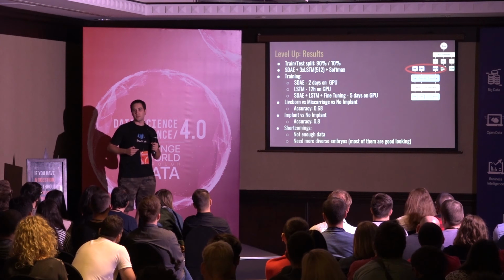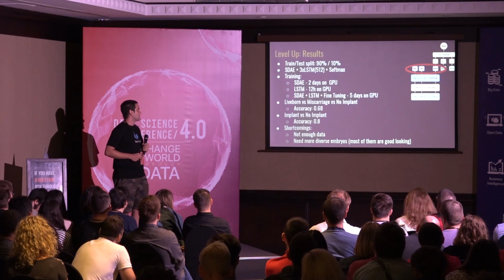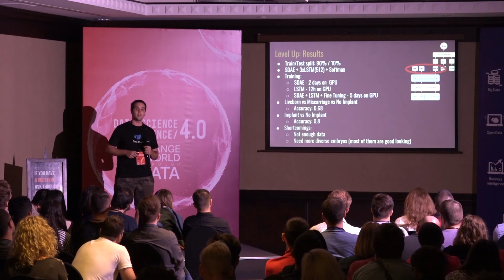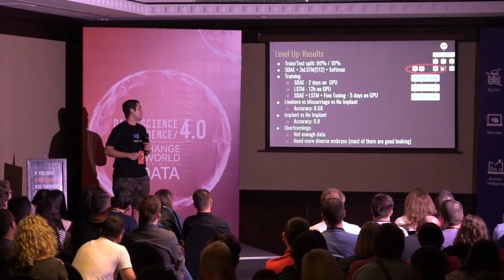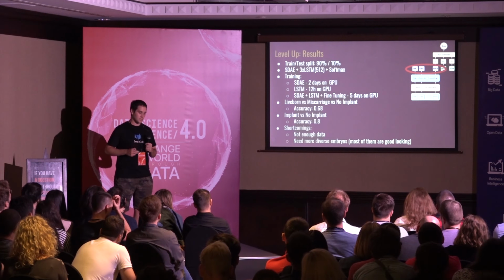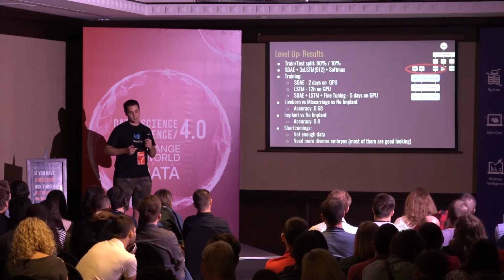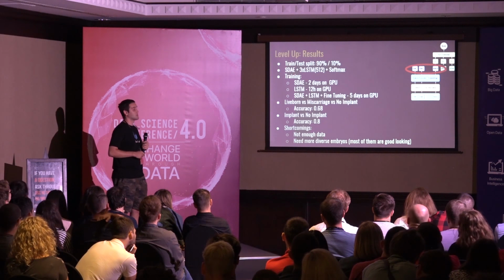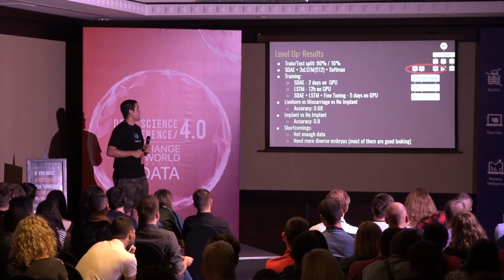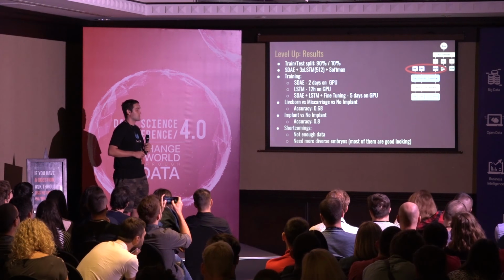Congratulations, we leveled up. We finished several quests. Basically what we have done, we split the train and test set. We trained UNET, which extracts the embryo from the image, and after some pre-processing, we trained a stacked denoising autoencoder with several layers, and the output of the autoencoder is transferred to the LSTM.